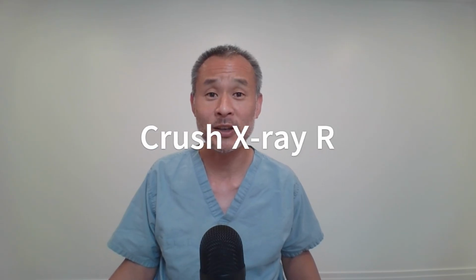How to read x-rays out loud. If you are a PA new to orthopedics or a medical student on orthopedics, you may be asked to read x-rays during fracture conference. This can be a scary experience, but also a great opportunity to stand out and be a star. To help you do this, I put together these talks called Crush X-ray Rounds.